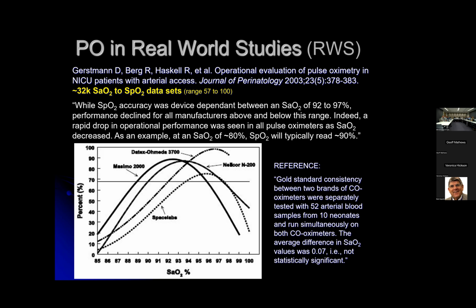And that's where this ARMS exceeded 10. So exceeded the standard. So it isn't reuse of sensors. This is real world studies in a very broad, large sample of patients, but they were all babies, and babies inherently have other issues. But I just wanted to make sure that you understood that that had nothing to do with reuse of sensors.